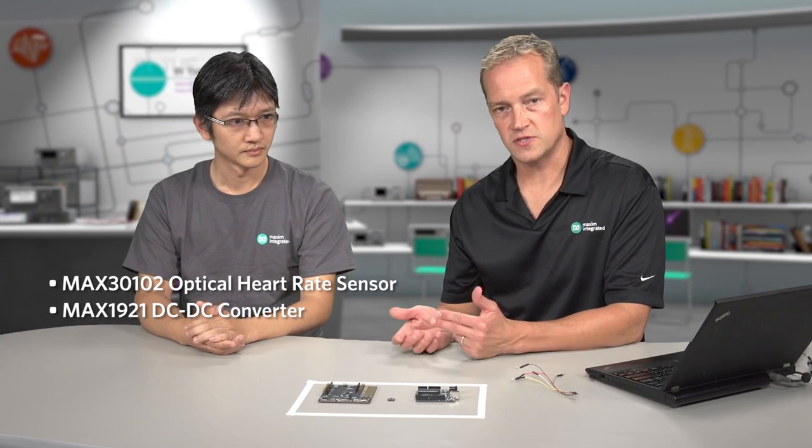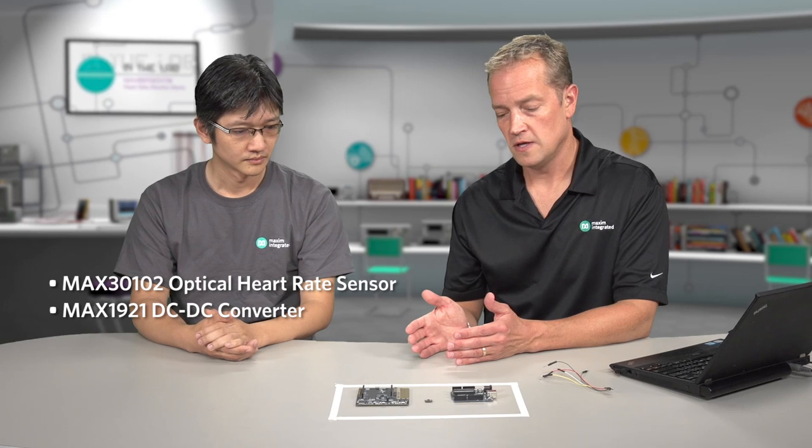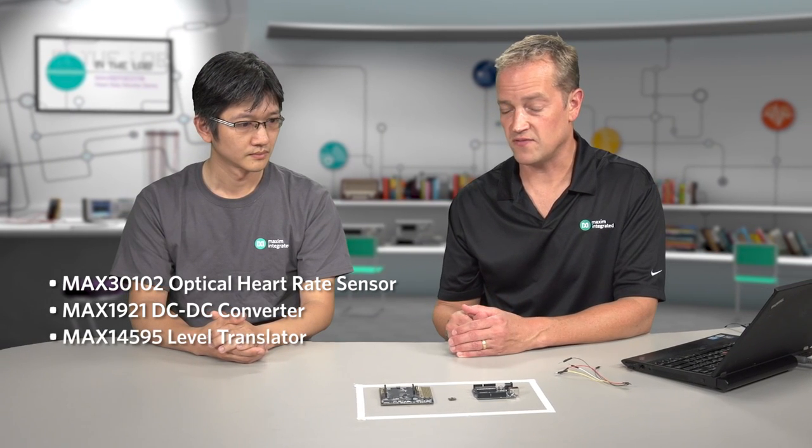And then we've also got two other parts on there, the MAX1921, which is a DC to DC converter that converts your input voltage down to a 1.8, which is the bias voltage of the heart rate chip, the MAX30102. And then we've got a level translator, the MAX14595, to translate the logic level voltage. Right, Gordon? Did I get it all right? Correct.